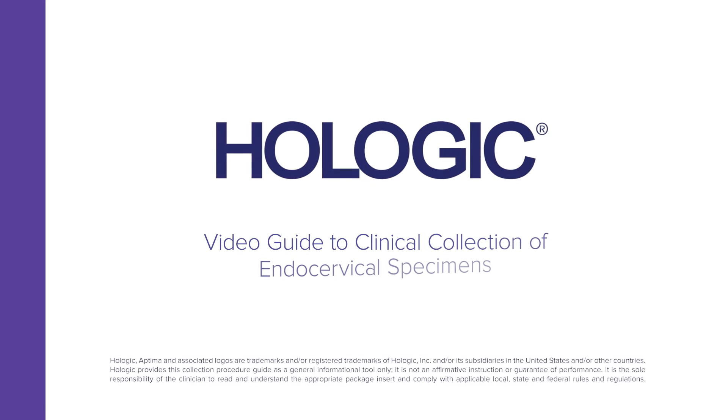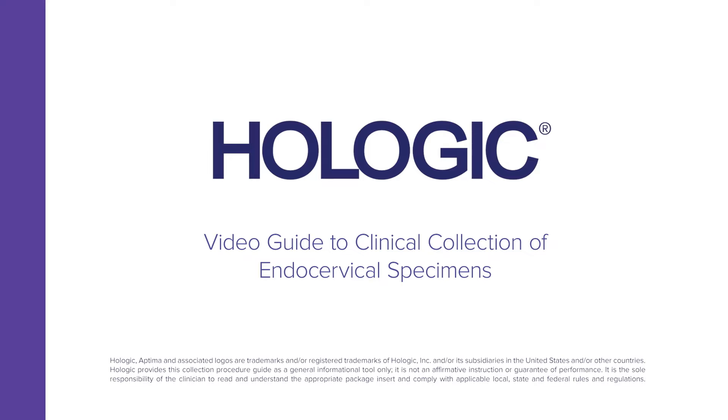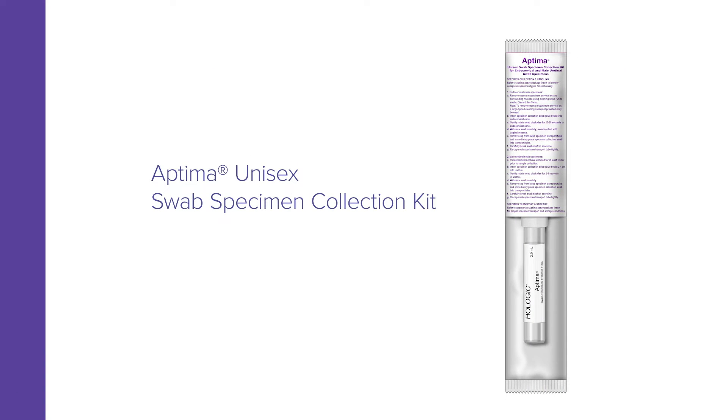Hologic presents a video guide to the collection of endocervical specimens by clinicians using the Aptima Unisex Swab Specimen Collection Kit.